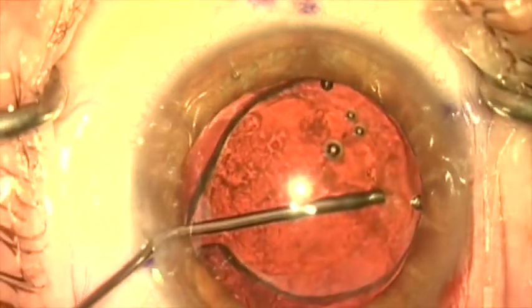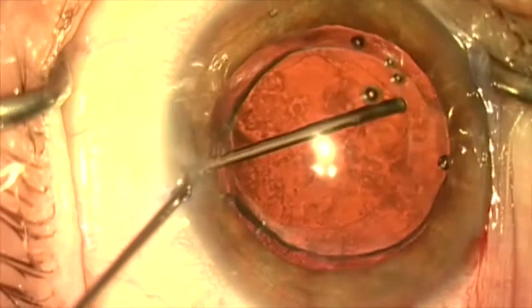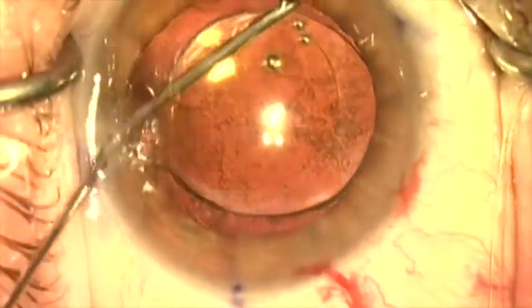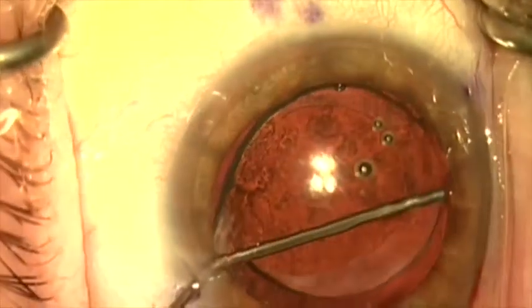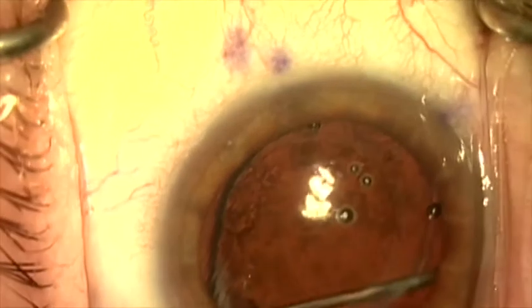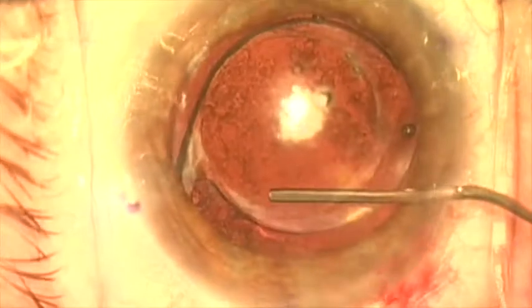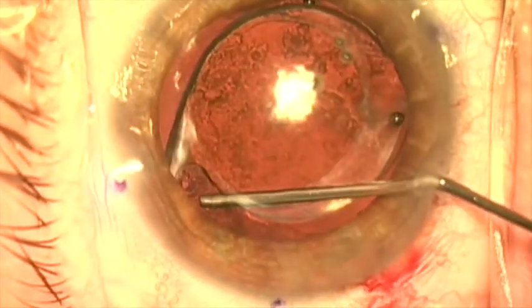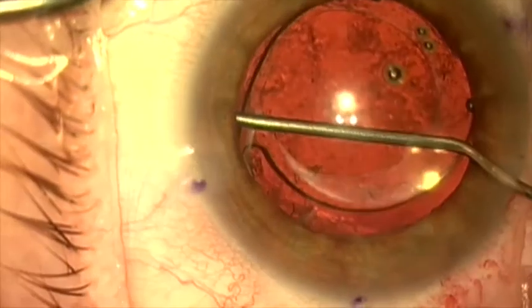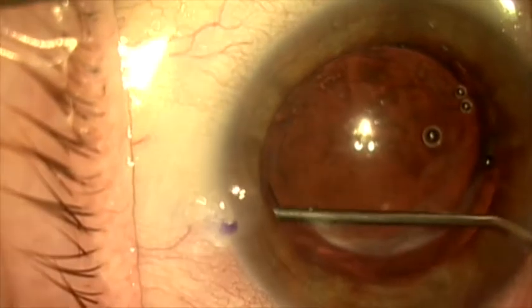Now we'll use cohesive viscoelastic on a 27 gauge cannula to complete the reopening of the capsular bag. This creates a nice wave of dissection behind the lens, as you can see here. It's important to reopen the bag 360 degrees to the equator to get rid of all the fibrosis, because we want to place a toric lens on a new axis. Here we're dilating open the capsular bag 360 degrees.